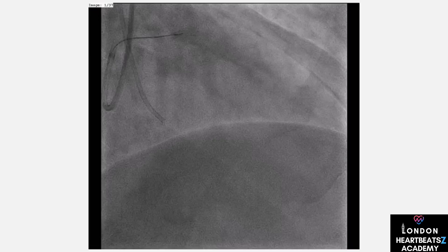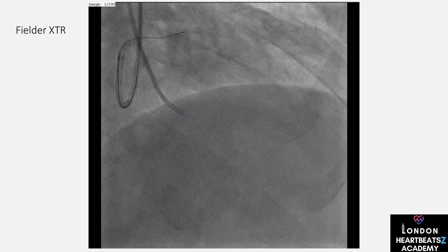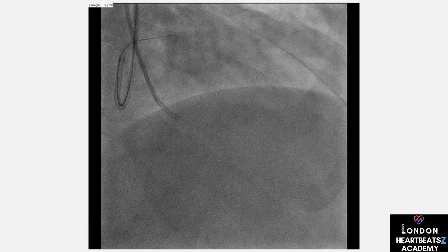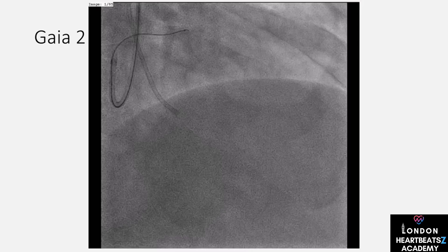When the wire exits into the sub-intima, we need to redirect it back into the true lumen — like correcting a detour on your journey. We use the Gaia wire for this, carefully adjusting its direction to re-enter the correct path.